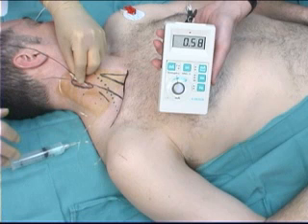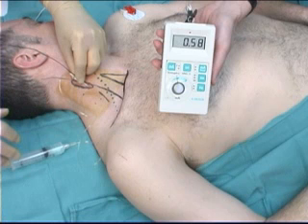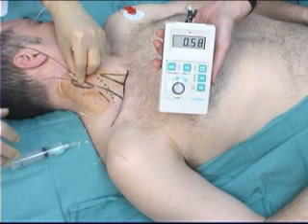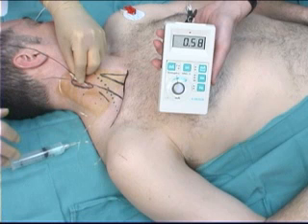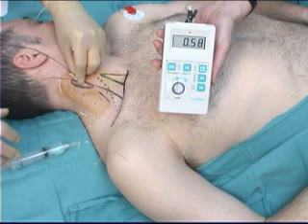A positive Raj test implies that the motor response immediately ceases after injection of the local anesthetic agent is started, as illustrated in this recording. This gives additional assurance that the block will be successful and that large volumes of local anesthetic agents and additives are probably not required.